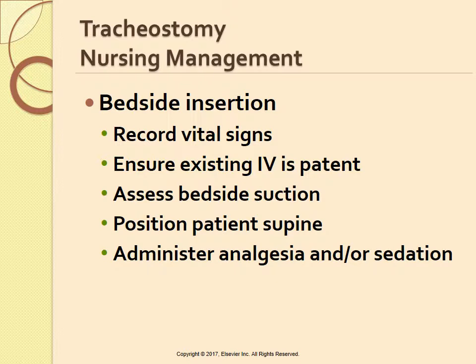If you are asked to help during the procedure, ensure you place the obturator inside the outer cannula with its rounded tip protruding from the end of the tube to ease insertion. After insertion, immediately remove the obturator so that air can flow through the tube. Keep the obturator in an easily accessible place at the bedside so that it can be used quickly in case of accidental decannulation.